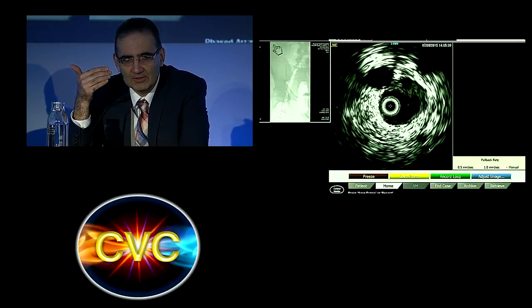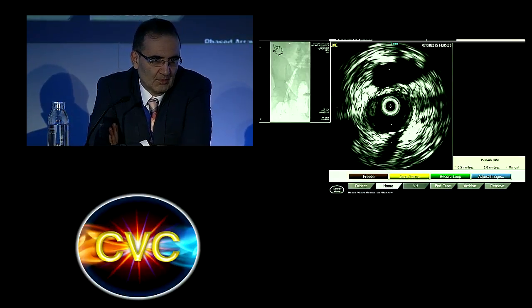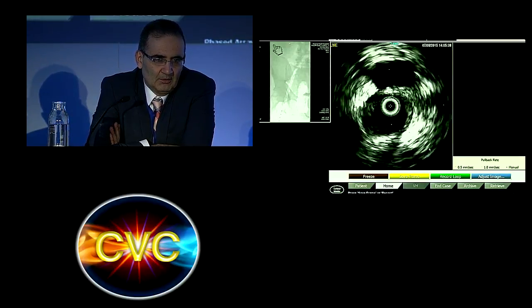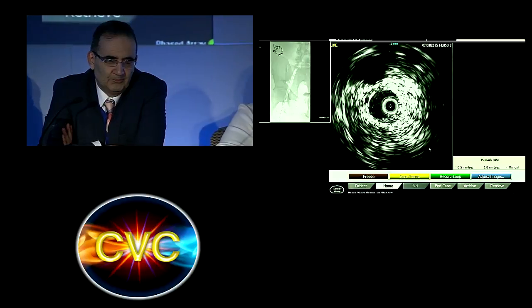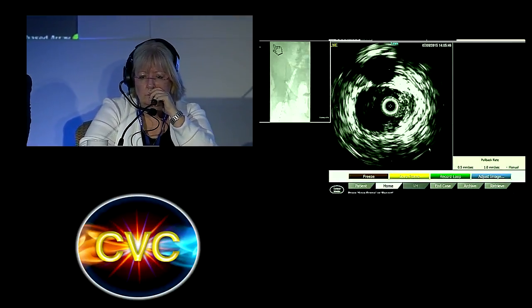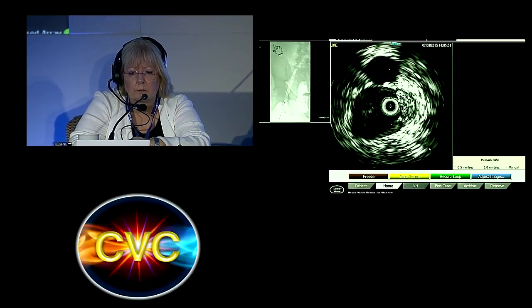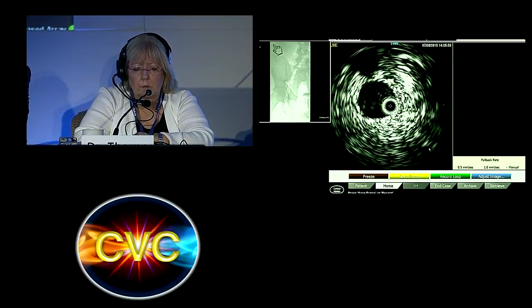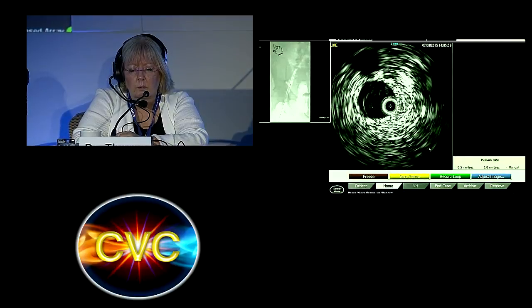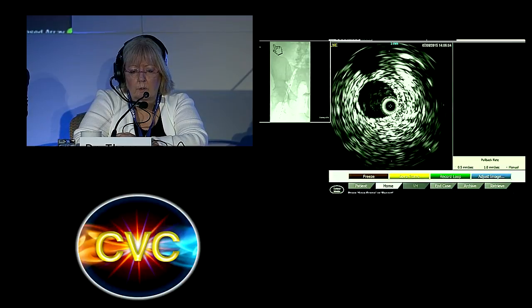Extending your stent below the inguinal ligament is not an issue. Yeah. We've done both ways. I see the point of stenosis on the stent. So we're talking about somewhere right here with the stent. So that gives us a length of possibly 6 centimeters of a stent located pretty much at that particular area, just at this location right there.